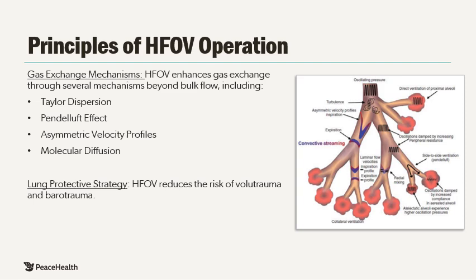By employing small tidal volumes and maintaining a constant lung inflation, high-frequency oscillatory ventilation also reduces the risk of volume trauma and barotrauma, common complications associated with conventional mechanical ventilation.